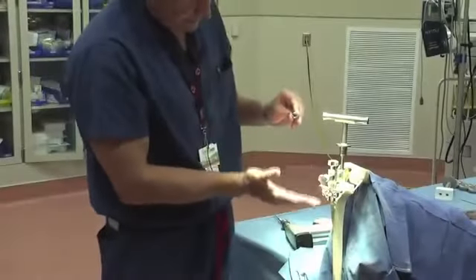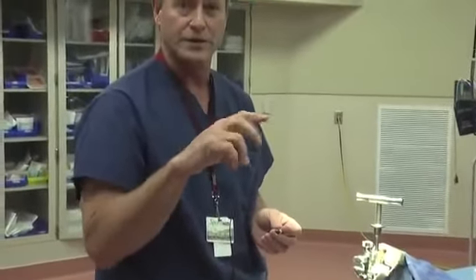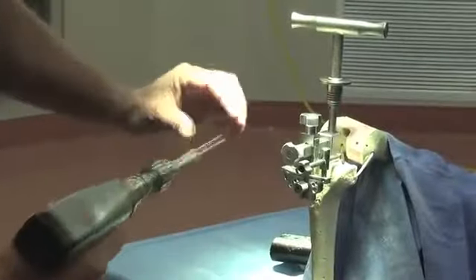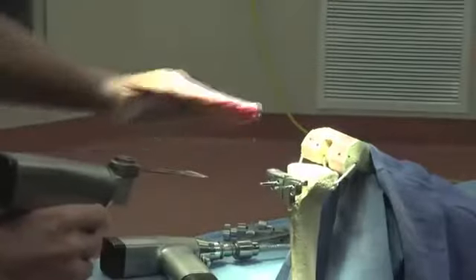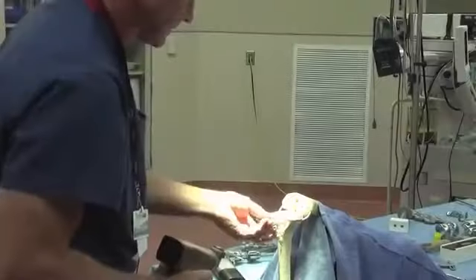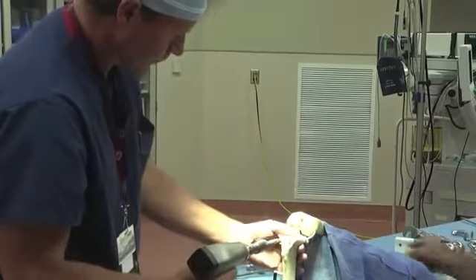We want to determine how far down the tibia we're going to make the cut. Usually all we're trying to do with these implants is make enough cut on the bone to get the implant in to the level that we want. When we get to that height, we want to lock that in and then go ahead and place our pins again. Usually we're doing a pretty flat cut here with just a little bit of slope to the back. The block will come back off and we'll go ahead and remove our pins.